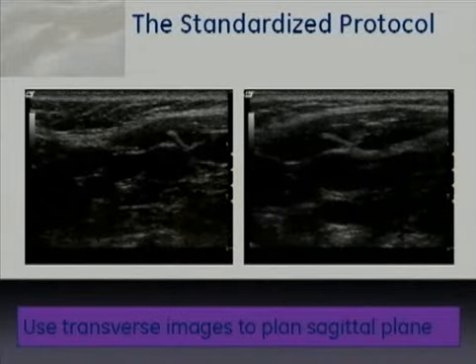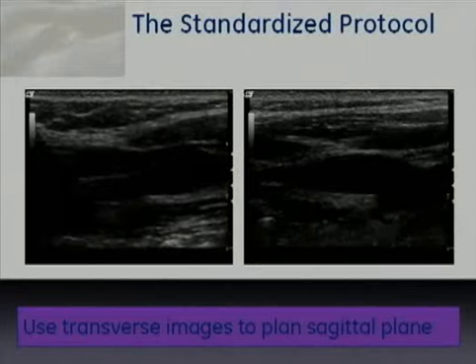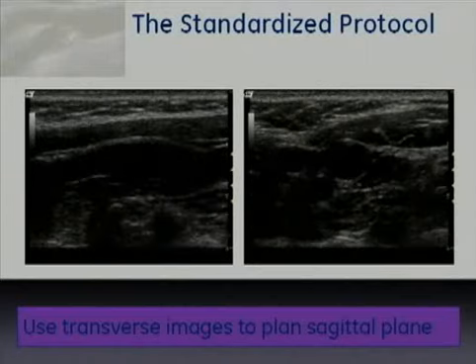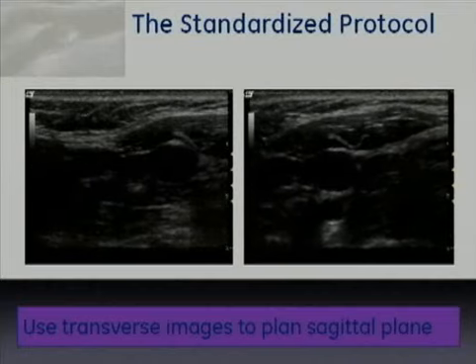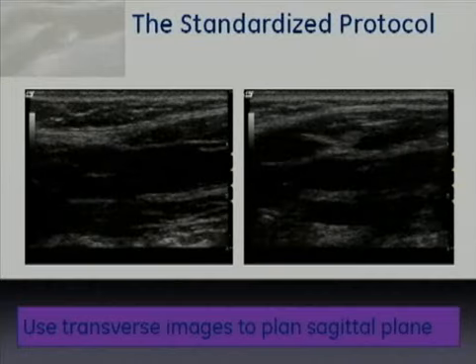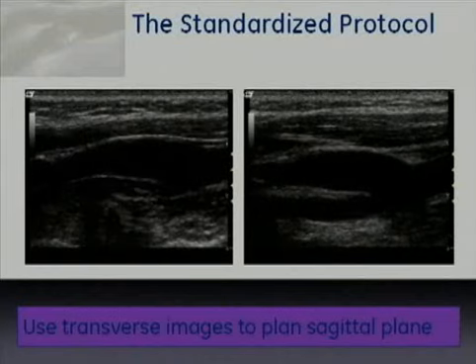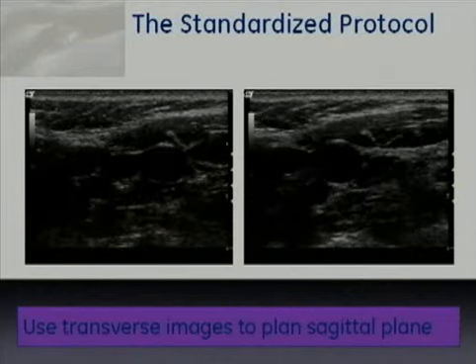On the other hand, if when I changed my approach to line the vessels up one on top of the other, if I moved medial or more anterior, then I would likely have the external on the top because it is more anterior or medially located.